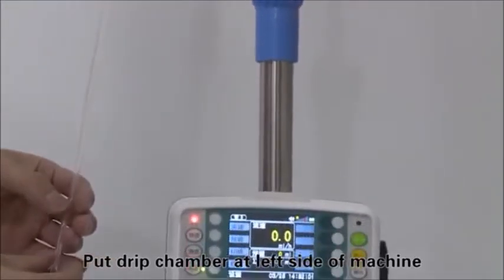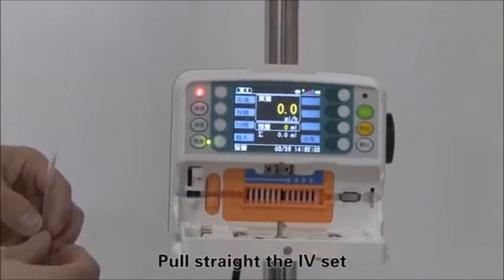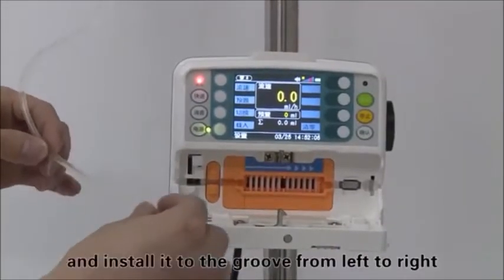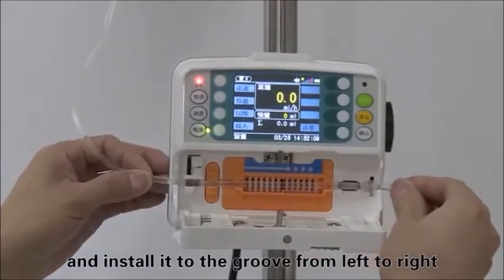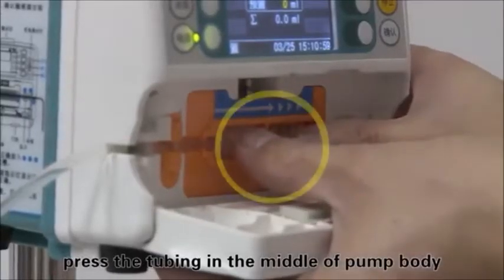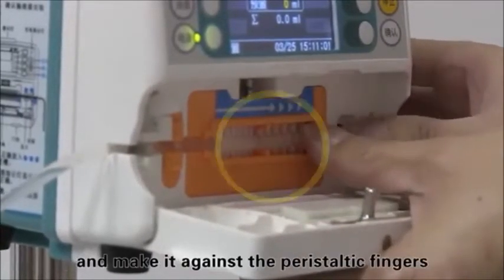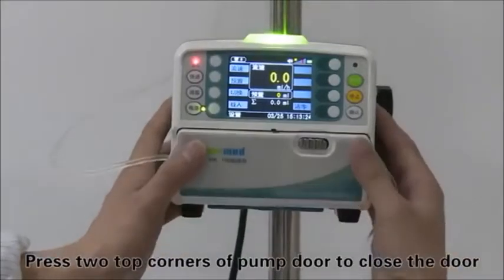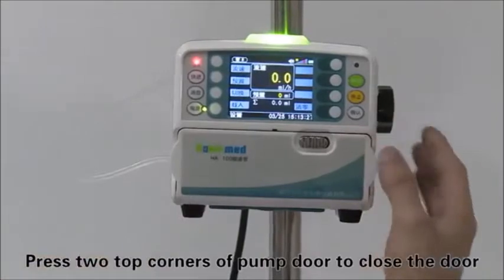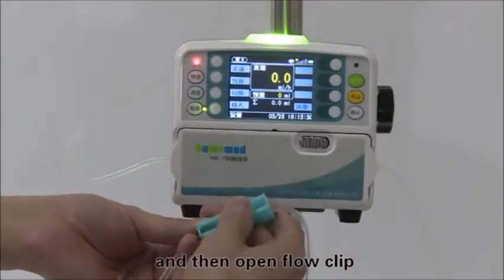Put the drip chamber at the left side of the machine. Pull the IV set straight and install it into the groove from left to right. Press the tubing in the middle of the pump body and make it rest against the peristaltic fingers. Press the two top corners of the pump door to close the door, then open the flow clip.